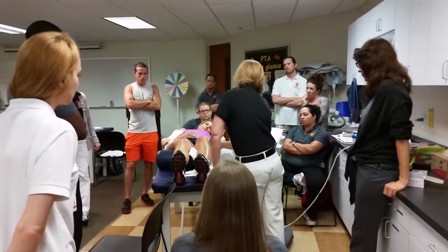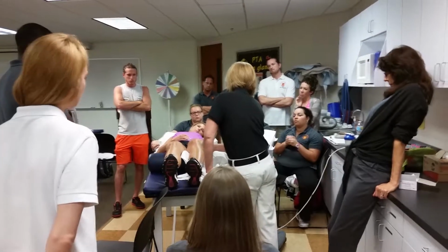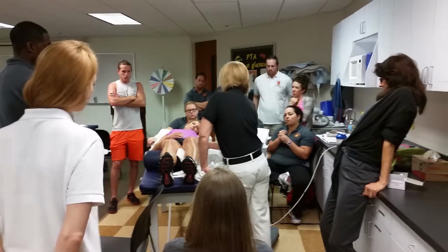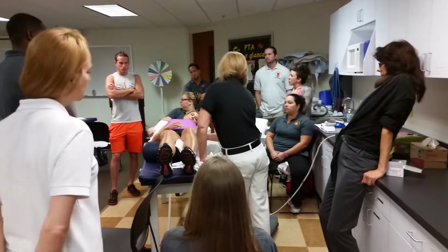So you have to turn it up as long as it's below the number that they've given in the plan of care. You can give anything up to that point. Just describe that as the thermal dosage, so that it's clear. Don't go above the plan of care.